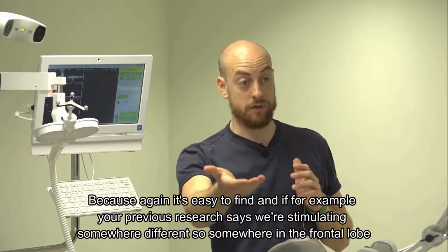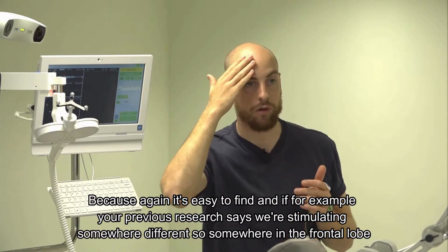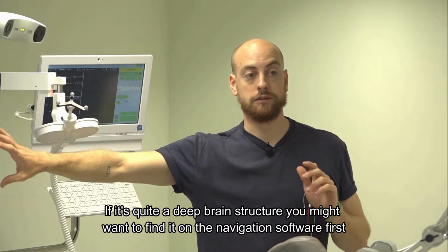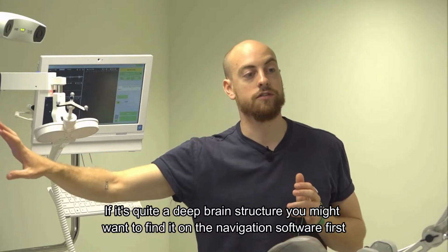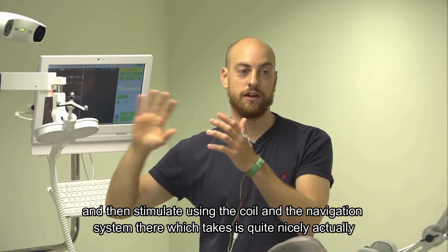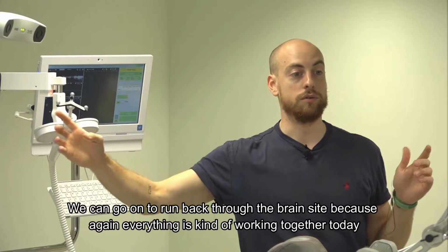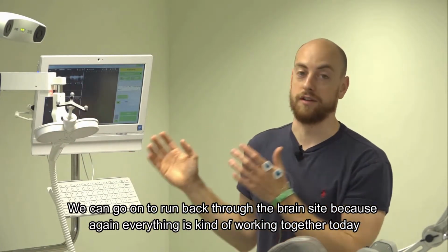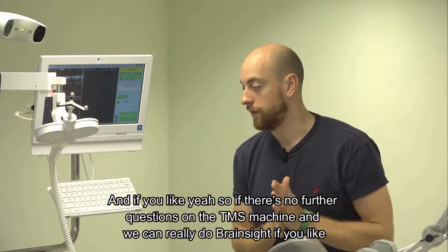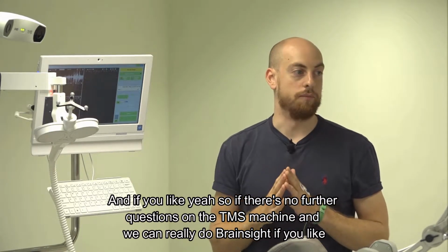If, for example, your previous research says we're stimulating somewhere different, somewhere in the frontal lobe, if it's quite a deep brain structure, you might want to find it on the navigation software first, and then stimulate using the coil and the navigation system there. Which takes us quite nicely on, actually, we can go on to run back through BrainSight, because, again, everything is working together today. If there are no further questions on the TMS machine, we can run through BrainSight.